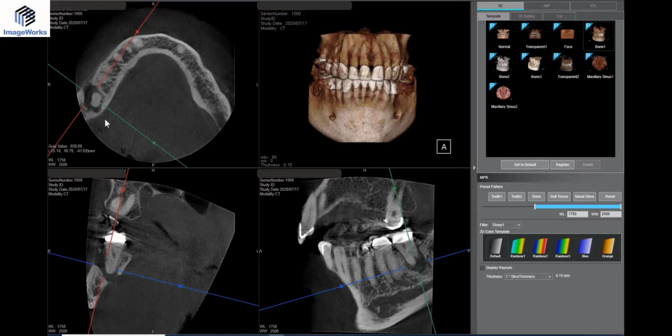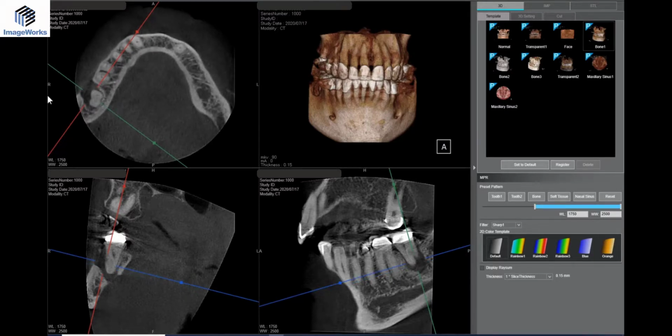Obviously when I treated this case, I had to build up both sides and put a guided tissue resorbable membrane and try to preserve that entire ridge, buccal to lingual and height wise. And he's just healing right now, so he's hopefully doing fine. Was this one of the examples where the patient was asymptomatic? He was asymptomatic except for drainage. It drained, but other than that, we never would have noticed anything.